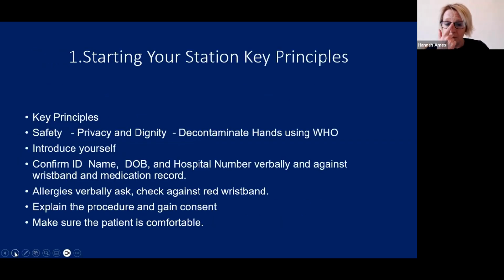So key principles, again, you don't always need to do safety, but we'd want to ensure privacy and dignity. We'd want to decontaminate our hands using that World Health Organization 7 steps. Obviously introduce ourselves. If it's clear in your scenario your ID checks have been done, don't waste time on this, but obviously confirm what the patient would like to be called. And the same with your allergies, that is normally completed, but just confirm that. Explain the procedure and gain consent.